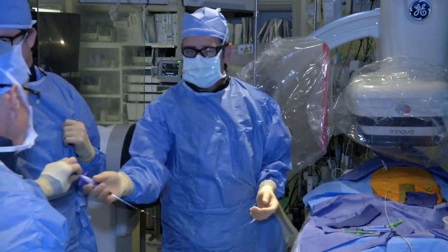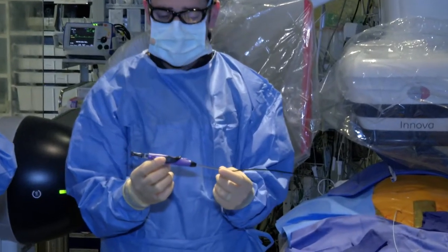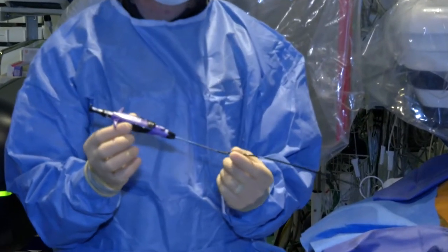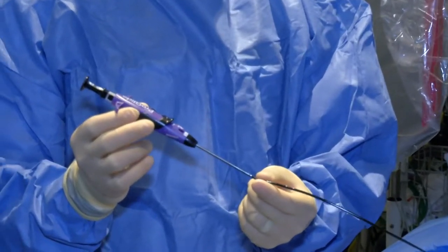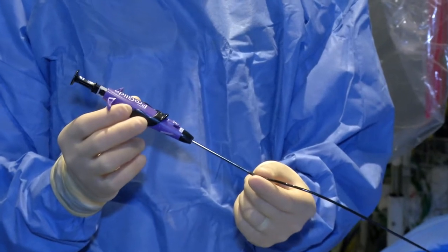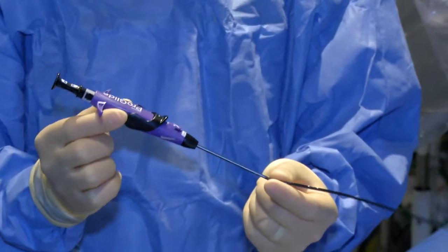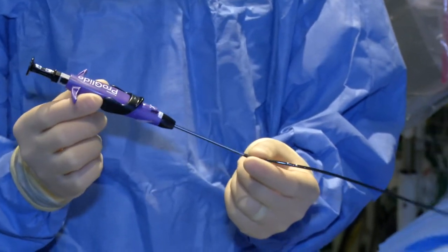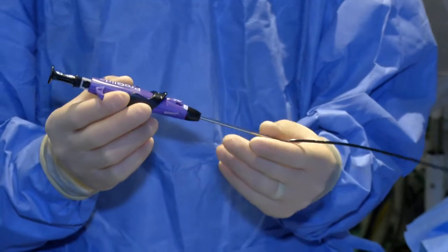Sorry. So this is what's called a Perclose ProGlide, an Abbott product. And this is a suture-mediated closure system. This was originally designed to use just one device to close a hole up to 8 French or so. But now we can actually use multiple devices to close larger holes. So we typically will use 2 of these, and I'll walk you through how we do that to close a larger hole. So that's how we do it.